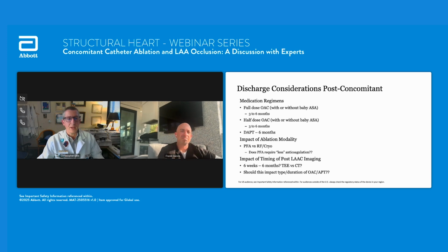For some of the concomitant patients, like the case I'm going to show, I did opt to go with half-dose DOAC and aspirin, and that seemed to work quite well. So that may be a pretty reasonable in-between for the patients that you ablate, right? Sure. But when exactly to image these devices, it's different. I don't know. For Watchman, I have been underwhelmed by the prevention of DRT theory of the Flex Pro, and I've pretty well gone back to full anticoagulation for 90 days if people can tolerate it.